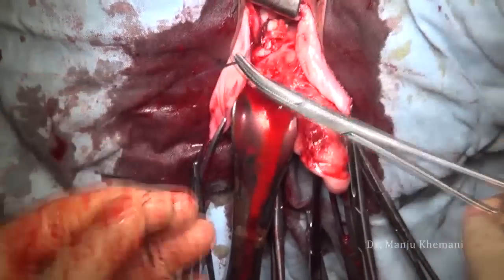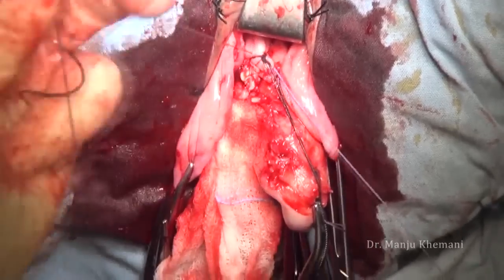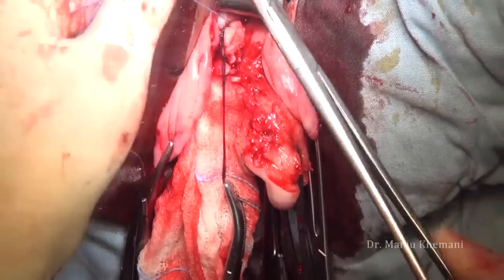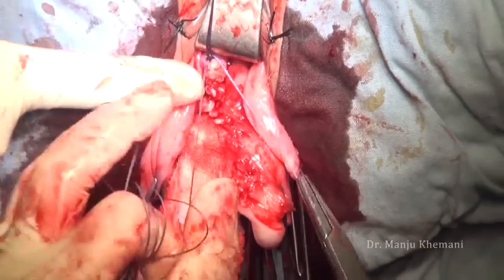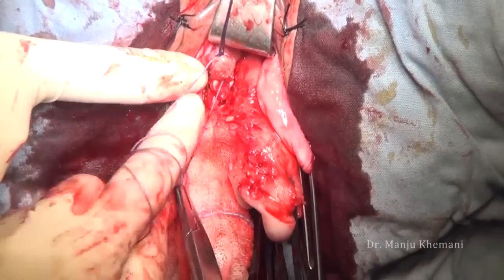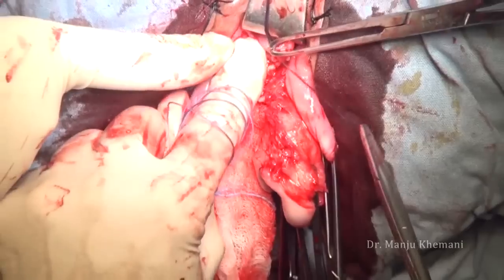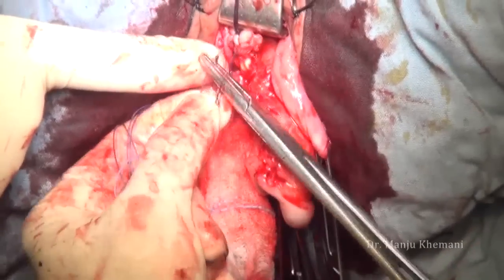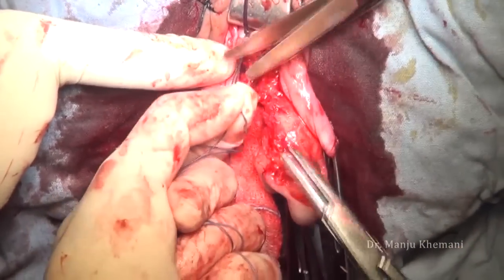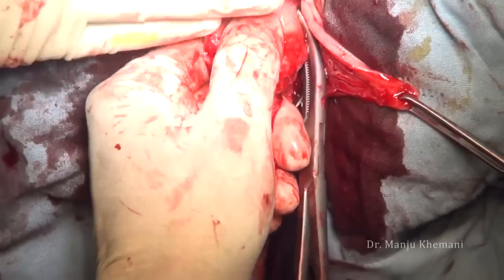It is always better to take a precaution and doubly ligate this pedicle. It wastes a little time, but at least you are sure you will not have a sleepless night and your patient is comfortable. Always take a reverse knot. The same thing is done on the opposite side after the uterines have been done. Here I have clamped it with two clamps because this pedicle is a little longer.